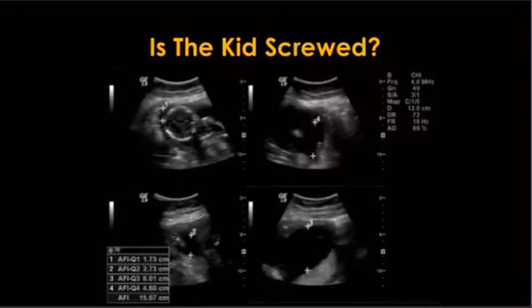So there's this entity called an amniotic fluid index, or an AFI. If the kid is measuring small and he has low fluid, which they call oligohydramnios, or if he has high fluid, which they call polyhydramnios, he's probably in trouble. He's probably getting a peg tube, and if he makes it, he's not having a normal life. No cheeseburgers, no soccer for him. Instead, lots of suffering and lots of medical bills, and parents getting divorced, all those kinds of things. So single motherhood is in your future, statistically anyway.